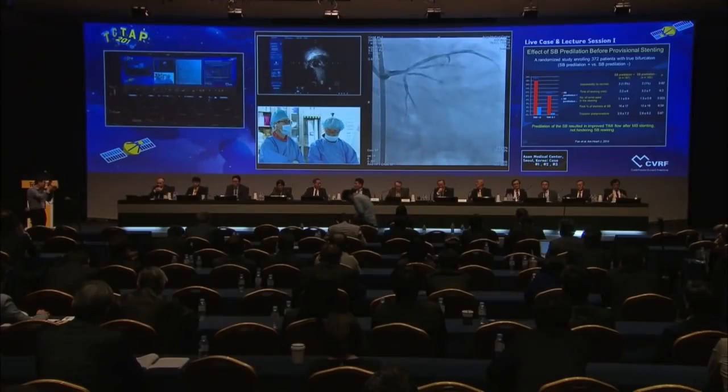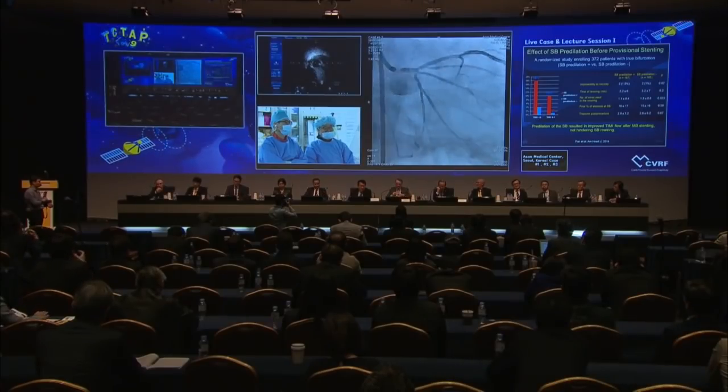Recent data show that if you do two stents quite well, with high pressure inflation, in terms of long term I think it's not too much different, even between single stent and two stent. Yeah, I fully agree. As Dr. Antonio Colombo said, don't feel guilty if you deploy two stents for any kind of bifurcation lesion. But before the provisional stenting technique, we have to imagine how much the difficulty will be. All right, you can do as you want.